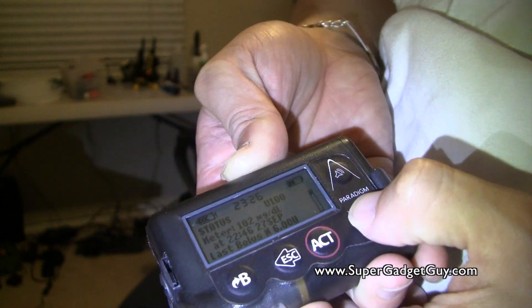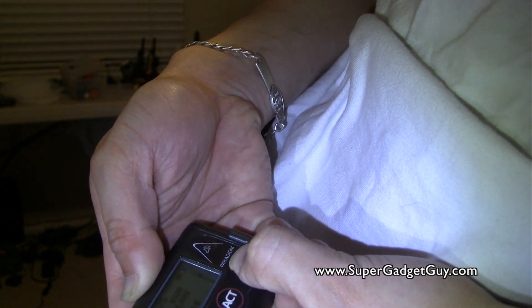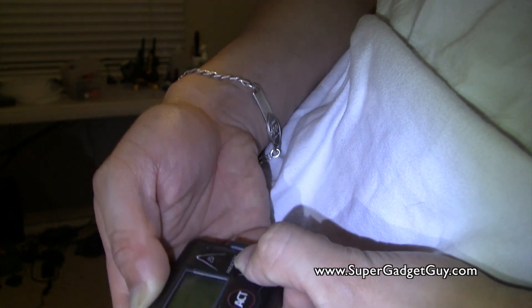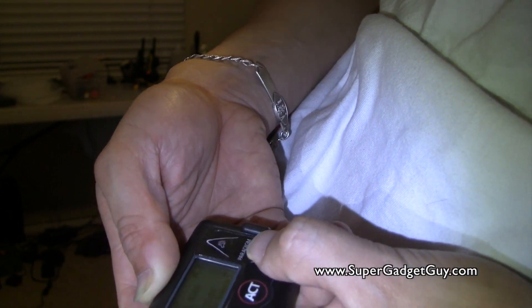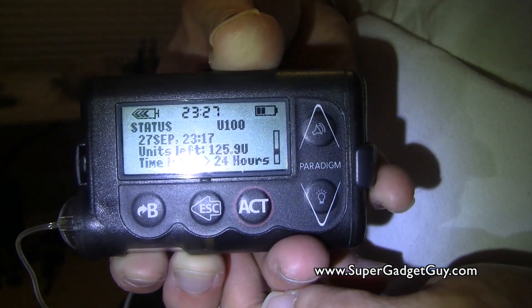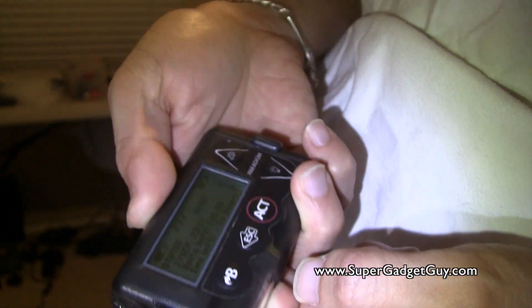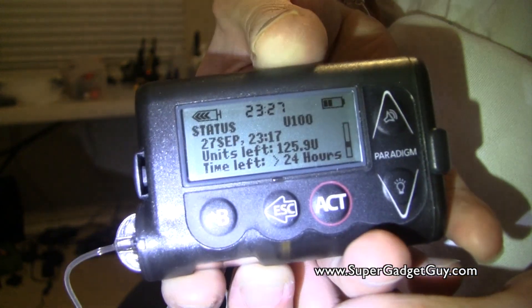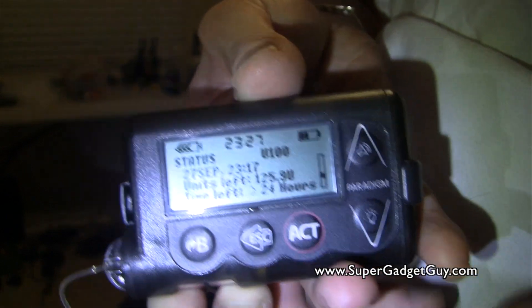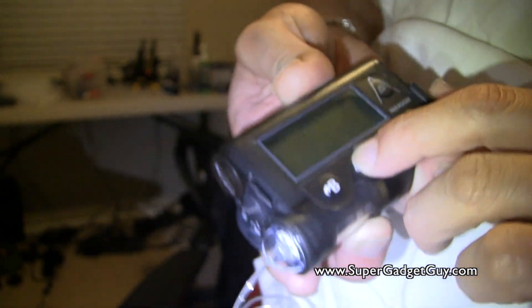And how many units I have left — you go to the Status menu. The screen is very hard to read. It shows you the date and time of the infusion set change, and I have 125.9 units remaining. The screen is not the easiest to read — I wish they fixed that.